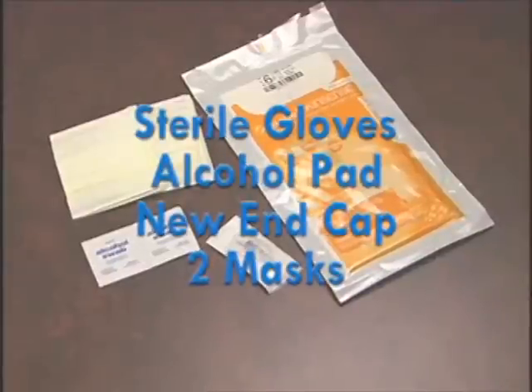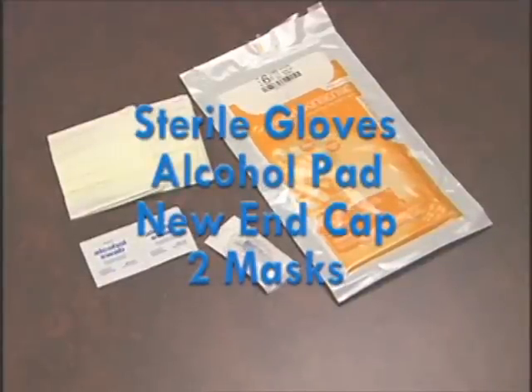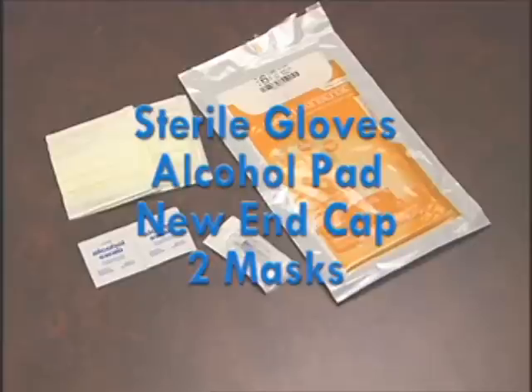Sterile gloves. Alcohol pad. New end cap. Two masks.